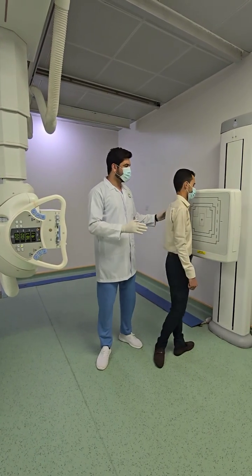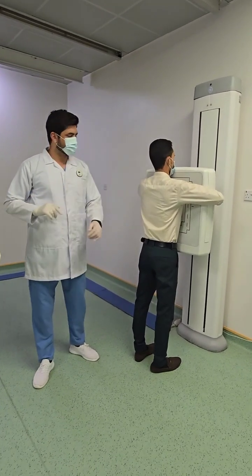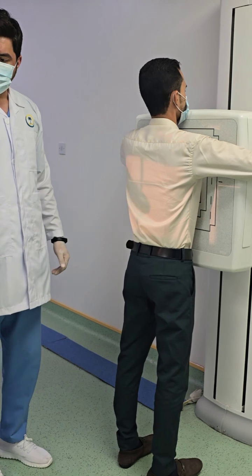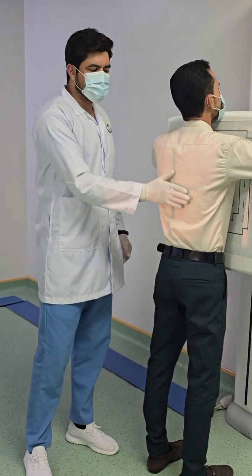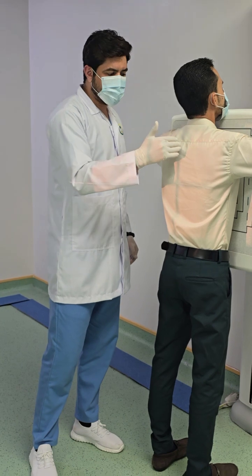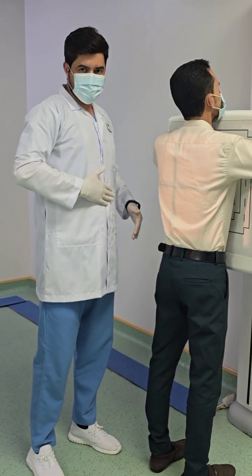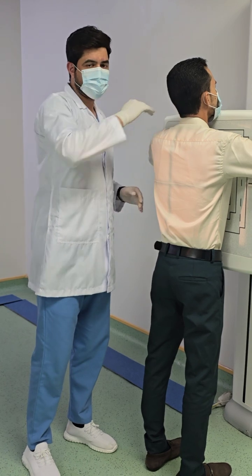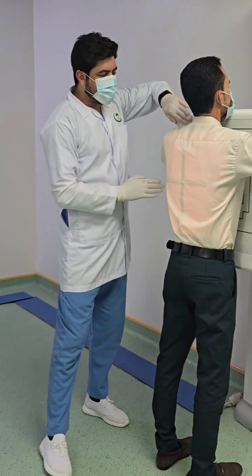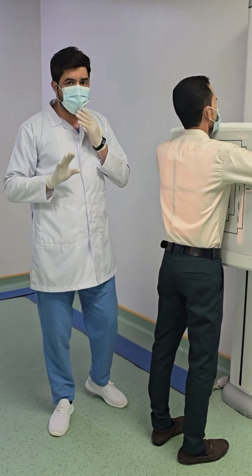And I will position Islam for the chest PA. This is the chest PA position. Now I will open the light. Okay, the X-ray is coming out, striking at the posterior aspect of the body. This is the posterior aspect of the body. Then getting into the body and emerging from the anterior. This is the anterior aspect of the body. Emerging from the anterior aspect of the body and finally striking at the receptor or the detector. This is the posterior anterior.